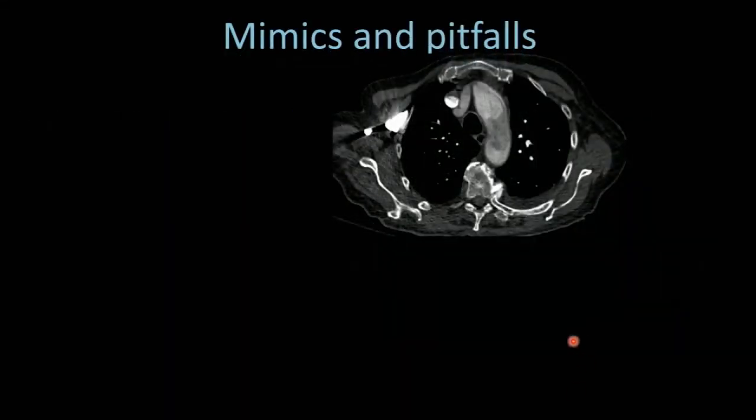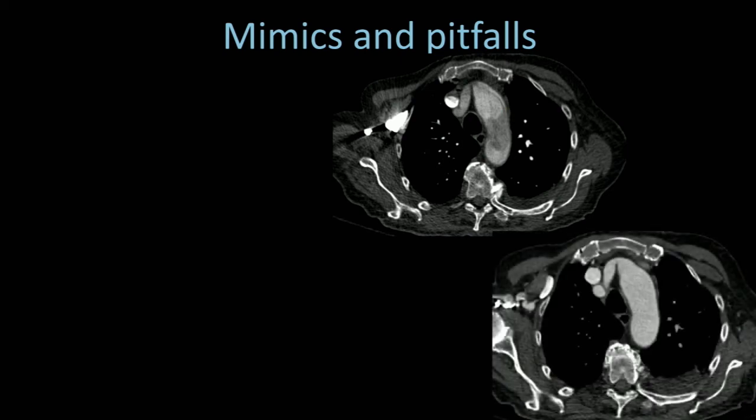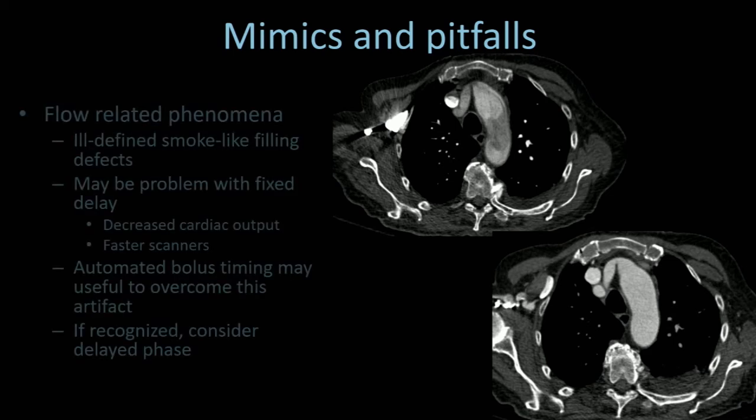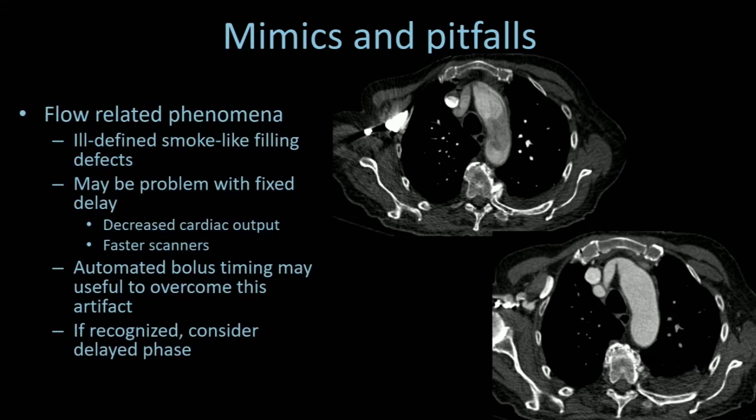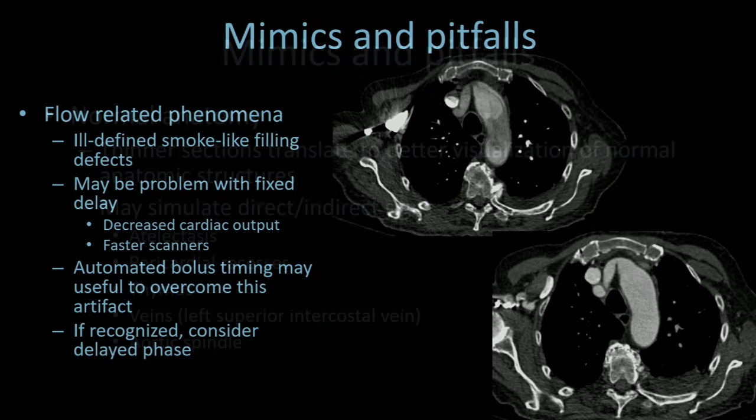Another important mimic: This patient was seen to have some filling defect within their arch. We noticed this and said maybe we're dealing with a flow artifact, so we scanned them in a more delayed phase. This patient had a low ejection fraction. This is simply a flow-related phenomenon. These ill-defined smoke-like filling defects can be a problem with fixed delay. Automated bolus timing may be useful, and if you see it, consider a delayed phase acquisition.